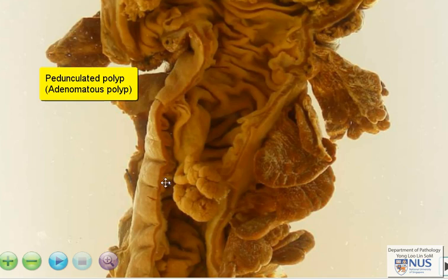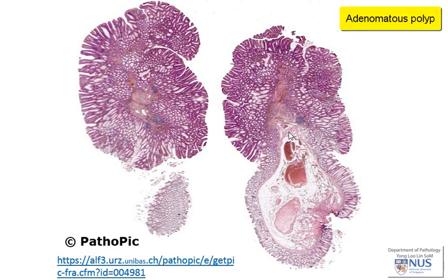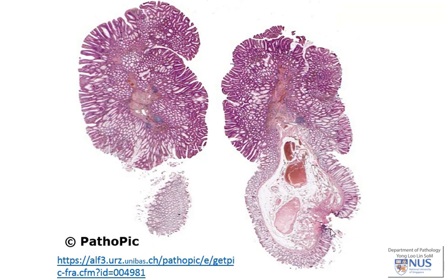Let's have a look at what the polyp looks like microscopically. This is a very low magnification microscopic appearance of a pedunculated adenomatous polyp. The polyp has been bisected and you can see two halves - in this half you can see the head of the polyp and the stalk. This area is cauterized due to endoscopic removal. The abnormal dysplastic mucosa appears darker on low power because of higher NC ratios, while the benign non-neoplastic colonic mucosa appears paler because of lower NC ratios.